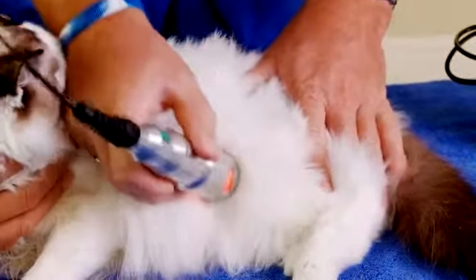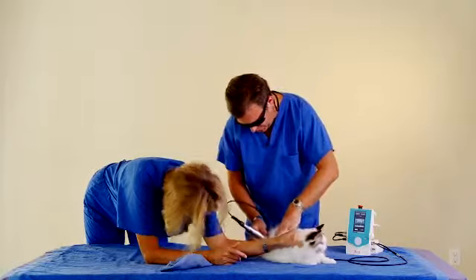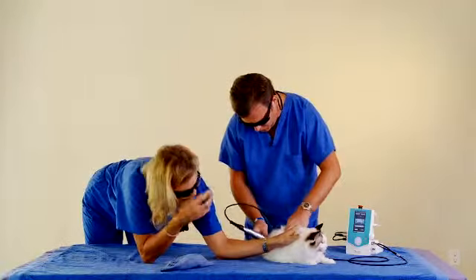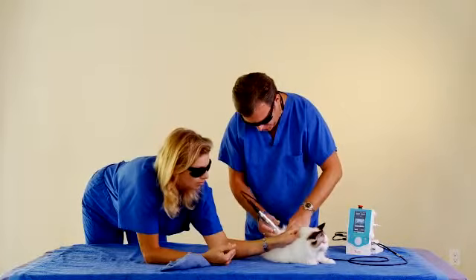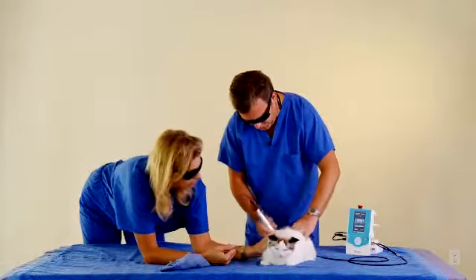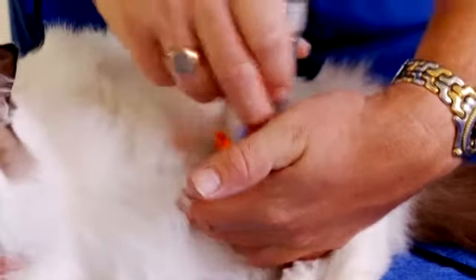Most of the time, in my experience, especially with equine and canine, by about the third or fourth treatment, your patient will actually enjoy this. Once they get past the point of knowing that you're not going to poke or prod them, you can do it at different angles. Again, you can do the different techniques of the rotation to get it into a joint area.